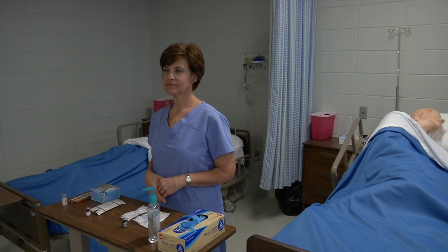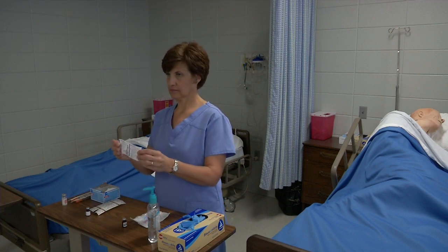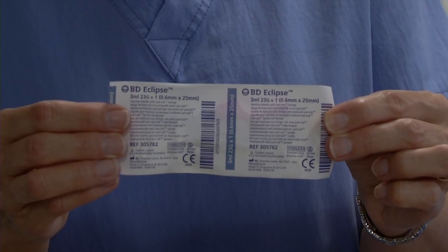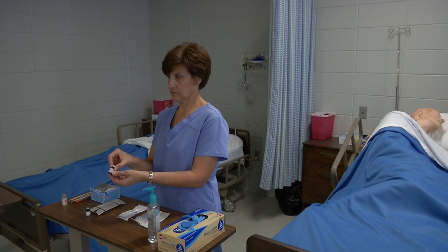We will start with the intramuscular injection. This must be performed at a 90-degree angle. You will choose a 20 to 25 gauge that is 1 inch to 1.5 inches long. You will draw up the medication. At this time, I want you to draw up Toradol 1 milliliter.